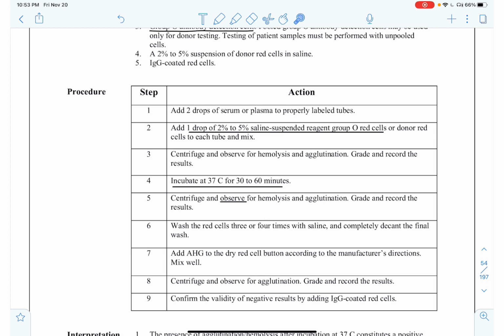And so saline takes about 30 to 60 minutes, whereas Liss takes about 10 minutes. So that was an interesting abstract that she wrote, which you can actually find at the Phyllis Unger case studies this year.